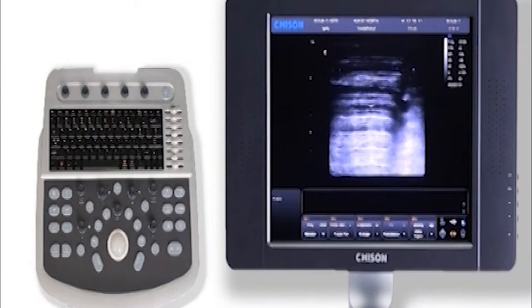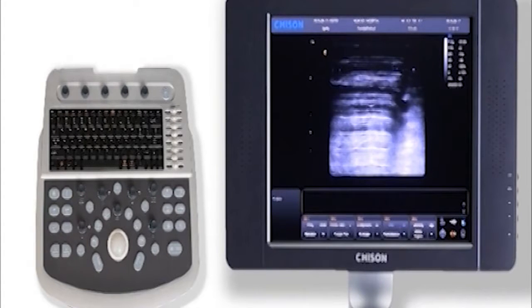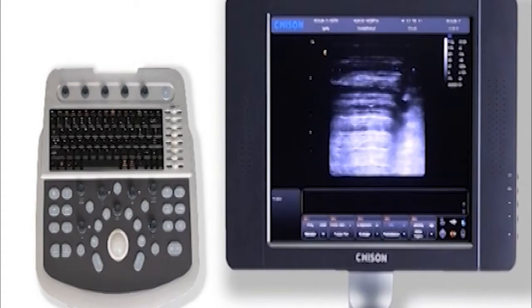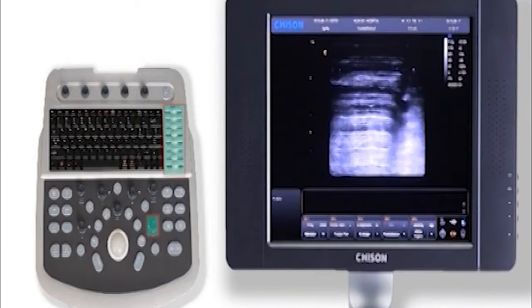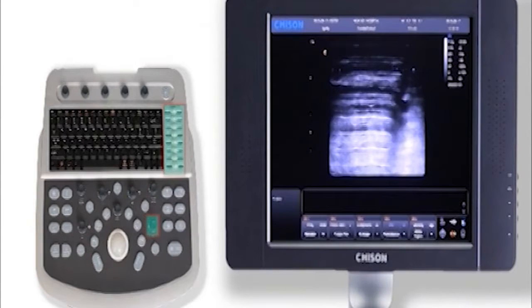In B mode, four parameters are the most important: gain, depth, frequency, and focus. Firstly, gain control consists of total gain and TGC.